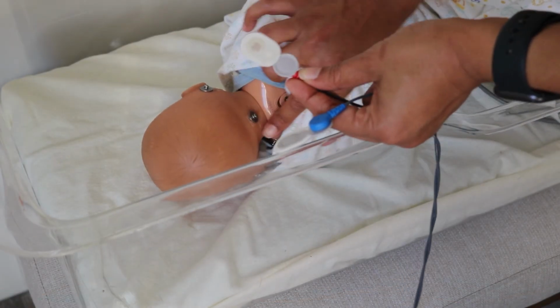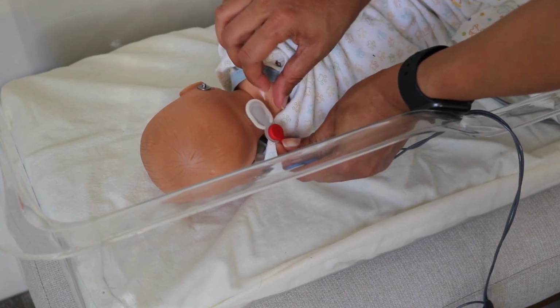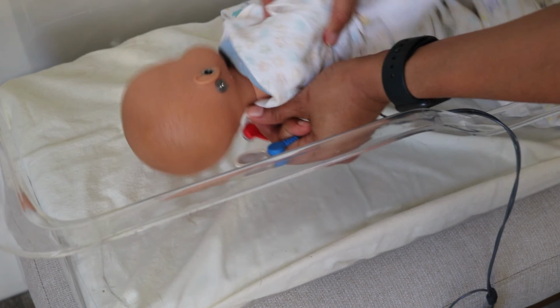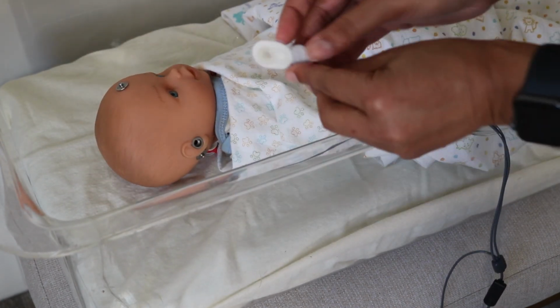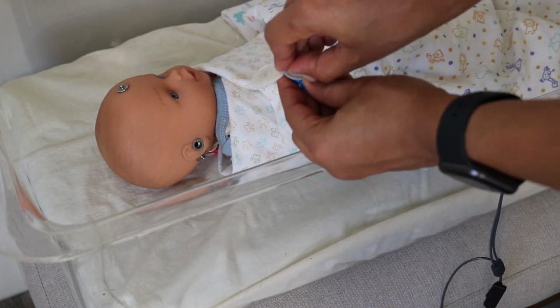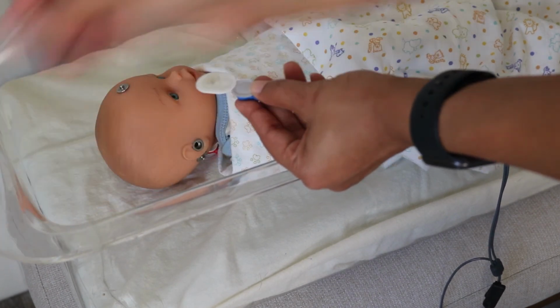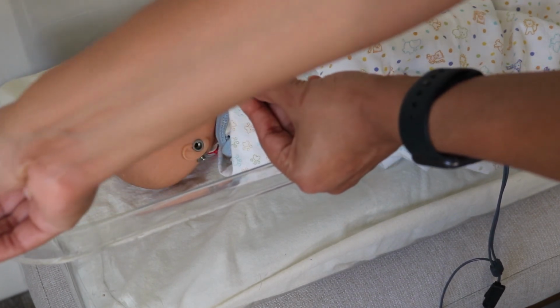Place the electrode connected to the red lead first on the nape of the baby right beneath the hairline. Place the electrode connected to the blue lead on the right shoulder of the baby. If the right shoulder is not accessible, use the left shoulder.